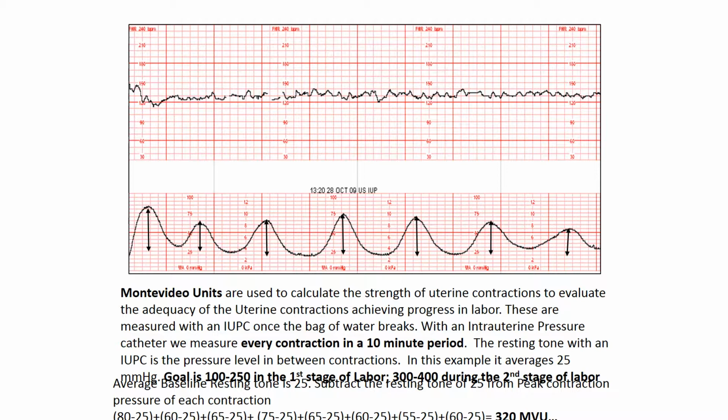So in order to see if this is too many contractions, sometimes we worry that if the contractions are too strong, it puts too much pressure on the baby and can cause the baby to be hypoxic. And as that uterus contracts normally, it creates kind of a hypoxic environment. So we want to make sure that too many contractions aren't occurring. That term is called tachysystole, which is greater than 5 contractions in a 10-minute period.